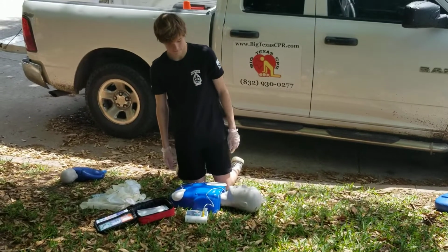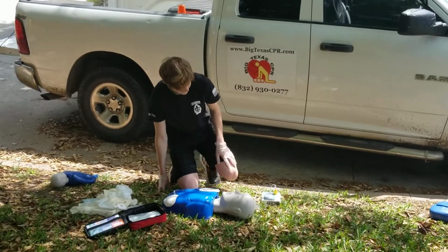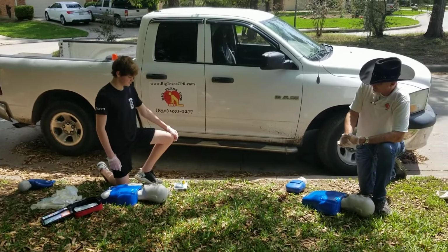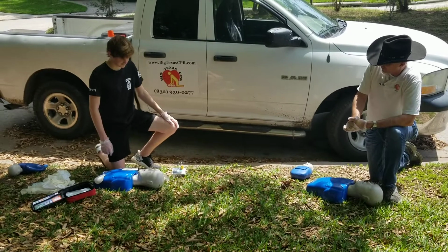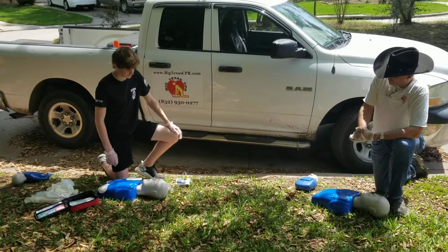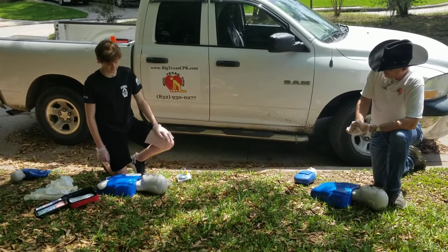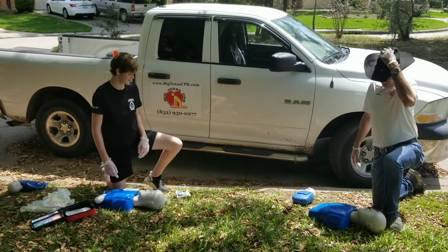Analyzing heart rhythm. Pick up the AED and put it on your side. Do not touch the patient. That's what you would do in real life. You'd have it right next to you. Shock advised. Charging. Perfect. Stay clear of patient. Deliver shock now. Press the orange button now. Shock delivered. Begin CPR. All right, you can turn it off. Turn the machine off. Perfect. Follow the instructions. Pretty simple.